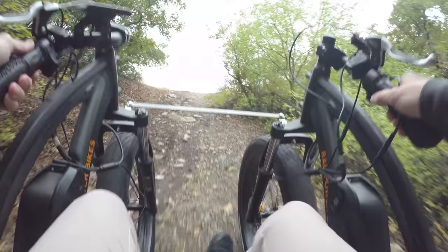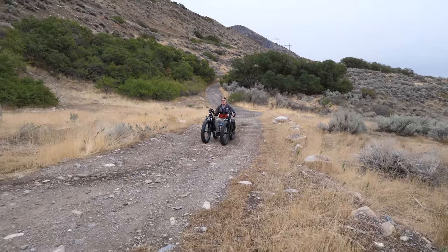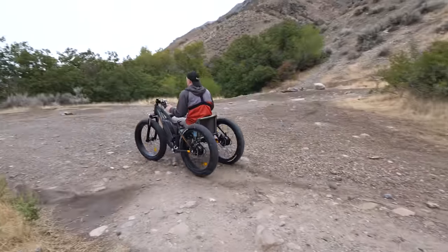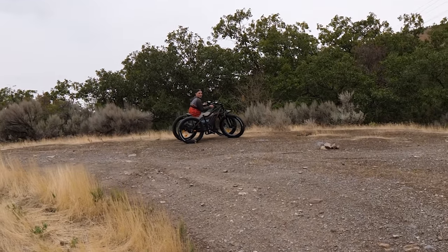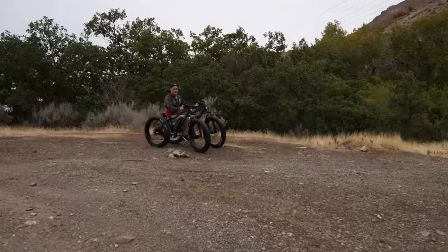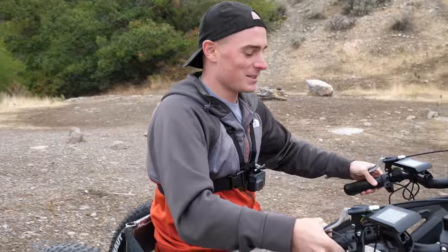I wonder if we had tires with a little more aggressive tread — the tires on this one are just tiny little niblets. Aggressive tread might be good. All four tires on the ground! It turns pretty tight, which is surprising. It would be impossible for a normal wheelchair to go where we're going right now, and that's with someone pushing it. This is fully electric.